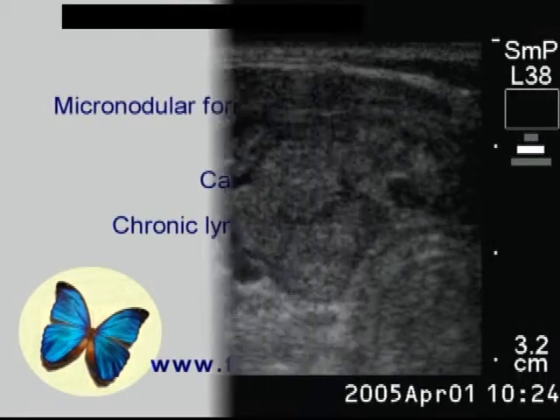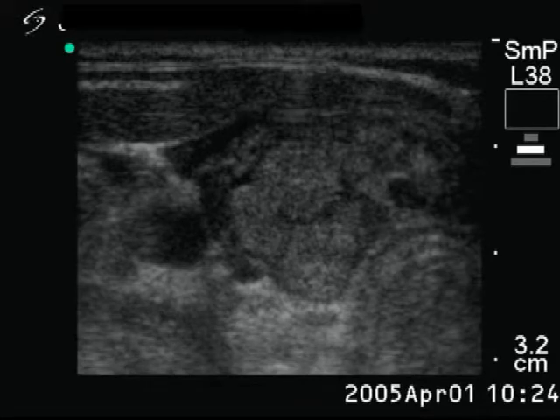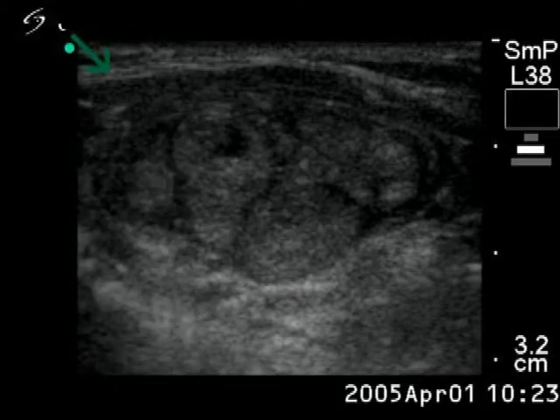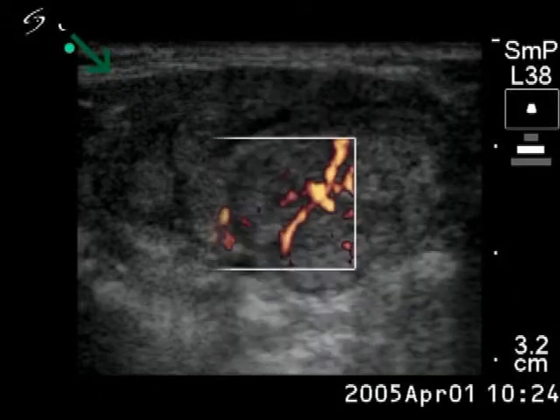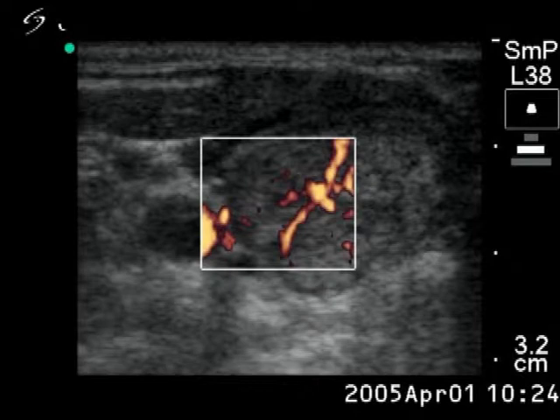The right lobe is composed of multiple isoechoic lesions which are separated by fibrous tissue. This is the so-called micronodular form of Hashimoto's thyroiditis. The extralobular part, marked with a green arrow, is moderately hypoechoic according to autoimmune thyroiditis. Paralobular blood flow is demonstrated.